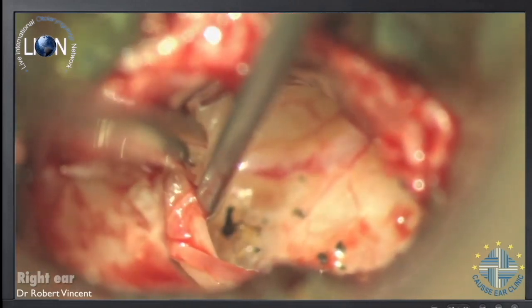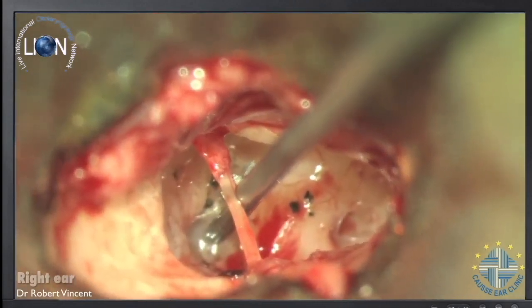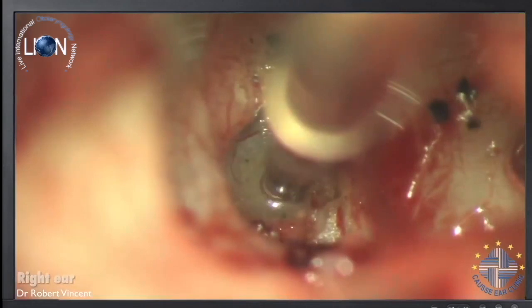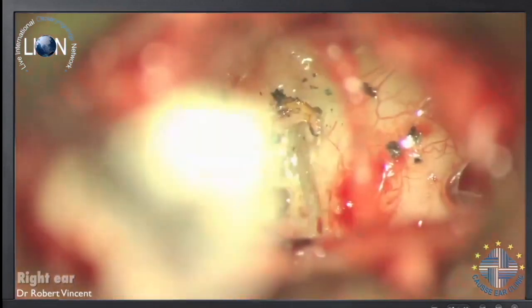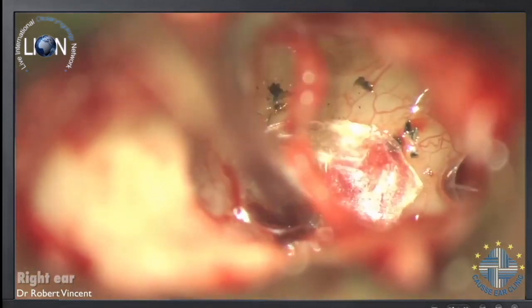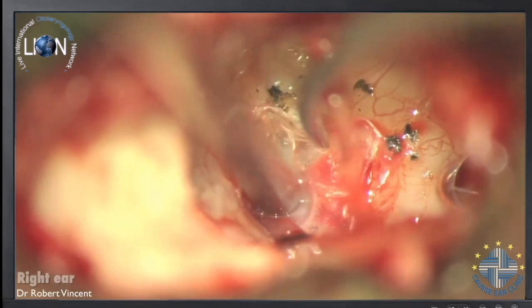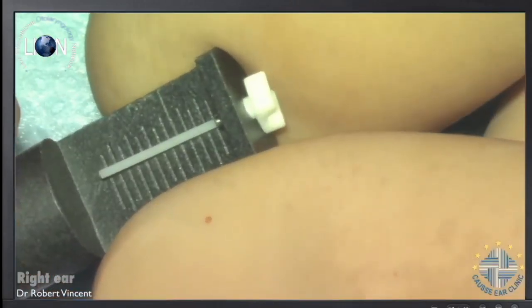There we go. And now you see I'm just placing the malleus over the stapes footplate, and I can now measure, sticking back the malleus to the tympanic membrane, and again measure using an elongated stapes measuring rod the distance from malleus to stapes footplate. And then of course I'm going to use the stapedotomy like this with the vein graft interposition, which is I think really mandatory when we are using a TORP.